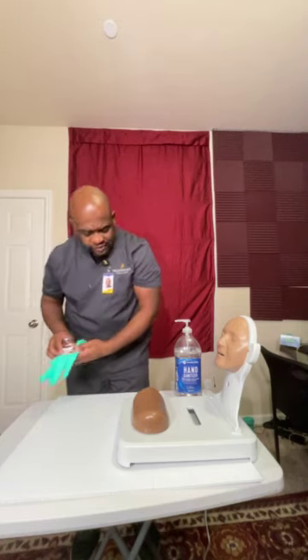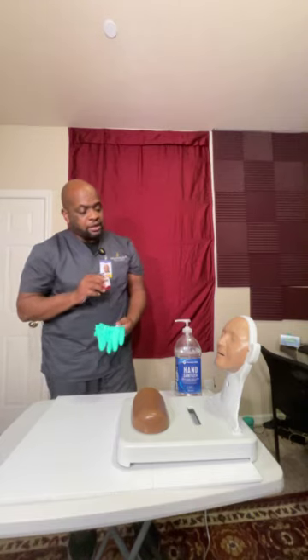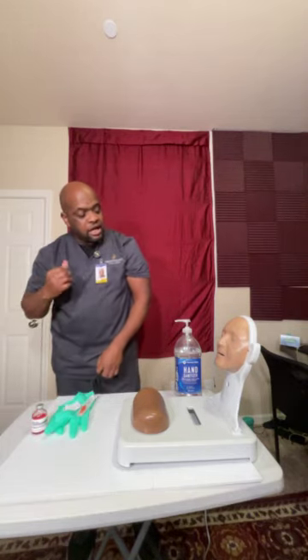I'll head into the patient's room and introduce myself. Knock, knock. Hello, Mr. Jones. My name is Robert. I am a nursing student from Nightingale College. The reason why I'm here is that there's a physician's order for you to receive an intradermal injection. So before I begin, let me put these items down, and I'll go ahead and pull your privacy curtain, and I'll wash my hands.